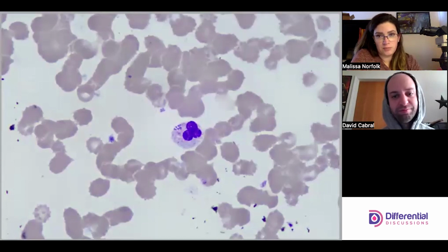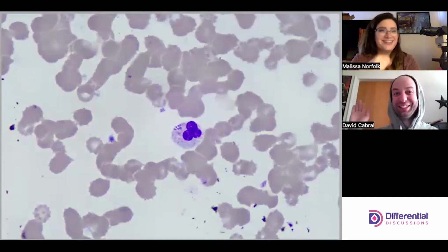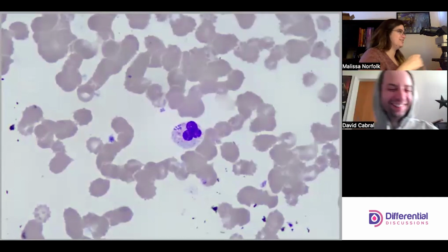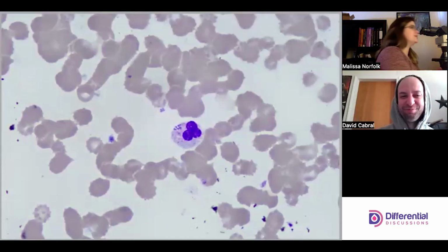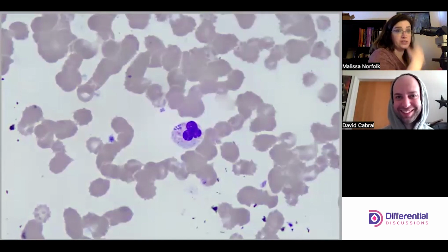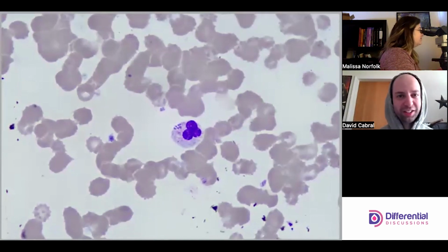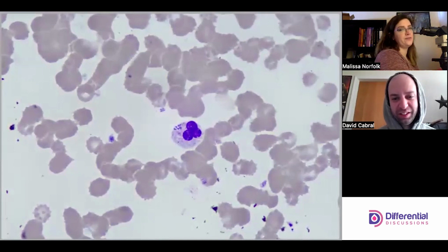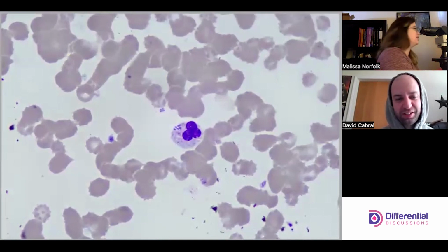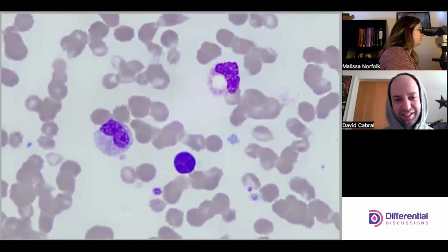But you know how we had the two neutrophils together and the bottom one we were questioning? The bottom one I'm kind of meh on, but the top one is it. These are the tricky things we talk about, where we may look at something and think, maybe I'll keep my eye out, and if I'm doing a diff, I might be restarting the diff. It's just so critical to the process. Let's see if we can find anything else. I don't know if we'll find anything quite this good, but let's look around a little bit.